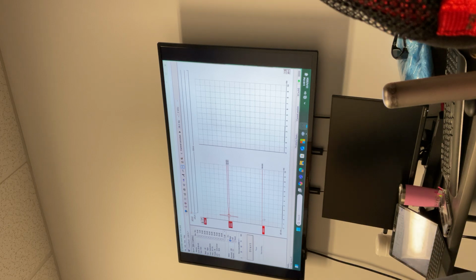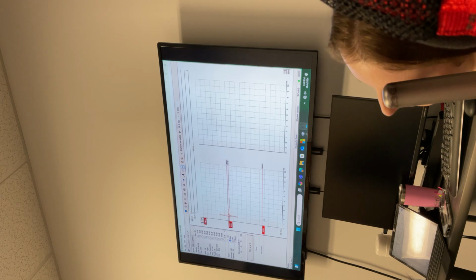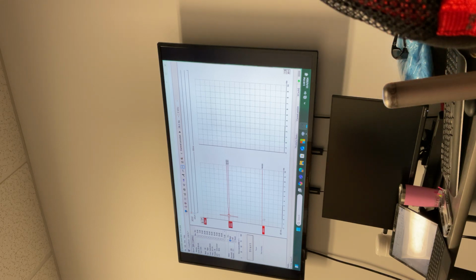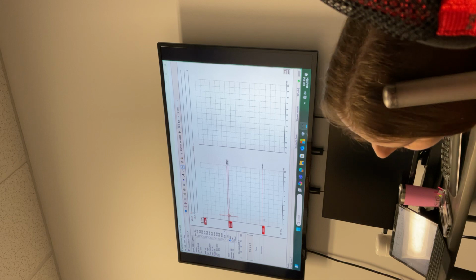At high intensity, particularly with bone oscillators, you have to use alternating because there's a lot of stimulus artifacts. You can see that stimulus energy is zero because it's getting cancelled out. So that's why at high intensity, if you're suspecting a lot of stimulus artifacts, you have to go with alternating so that the stimulus energy is getting cancelled out.